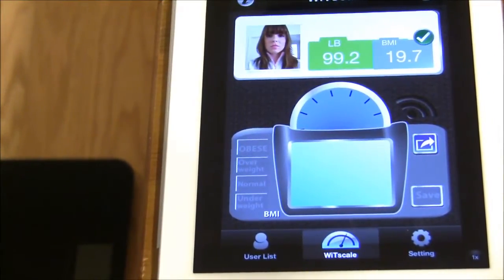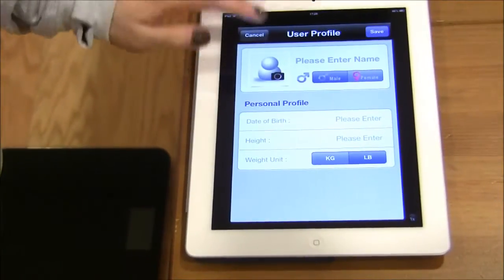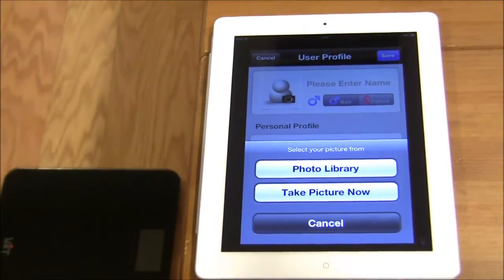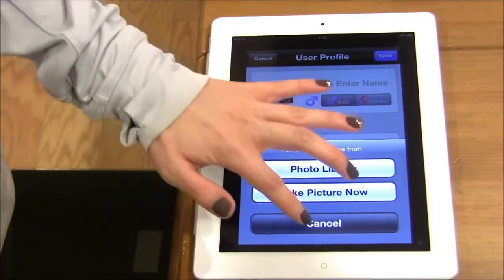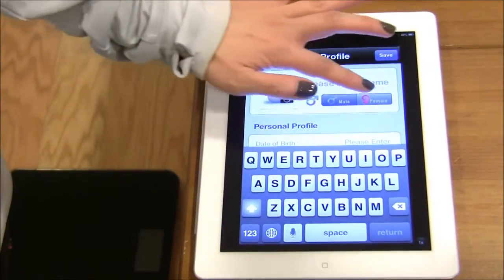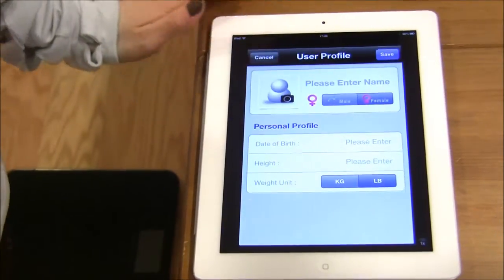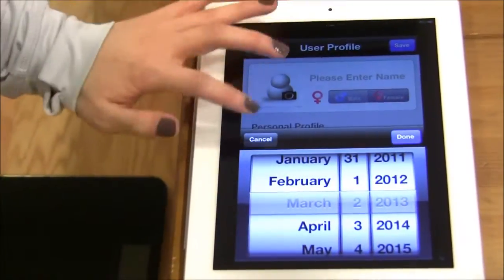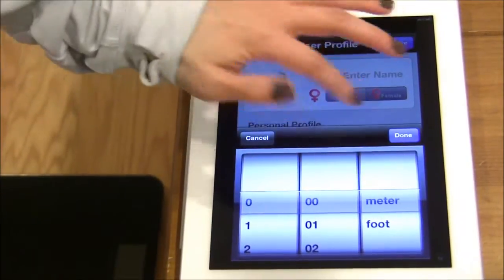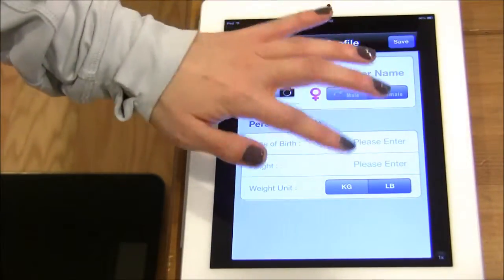To create a user profile, click this icon and you can either take a photo or upload a photo from the photo library. Enter in your name and click male or female for gender. Enter in your date of birth, height in meters or feet, and your weight in pounds or kilograms.